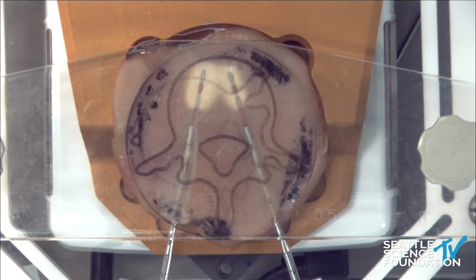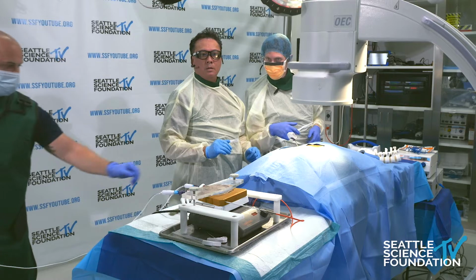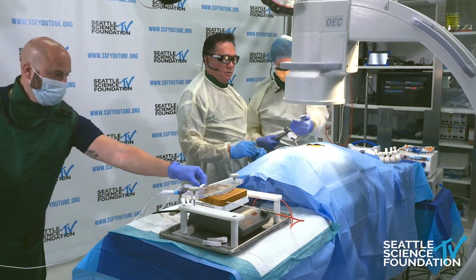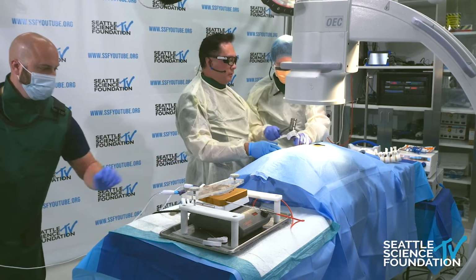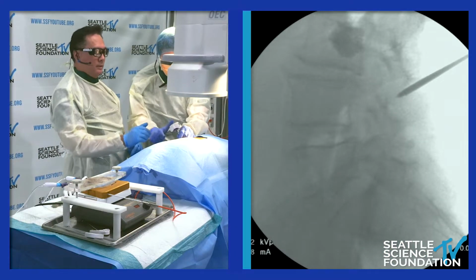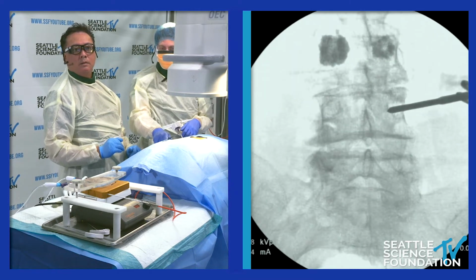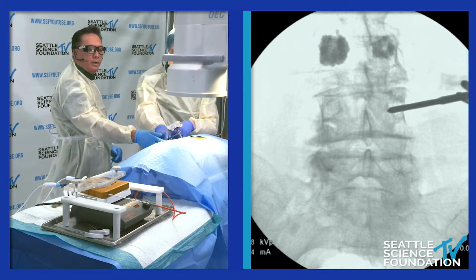AP. And then probably a more cranial angle. Yeah. Have a look. So Glenn, Linda's going to get mad at us here if we don't show us a vertebroplasty. There we go. Okay. Let me have a look.